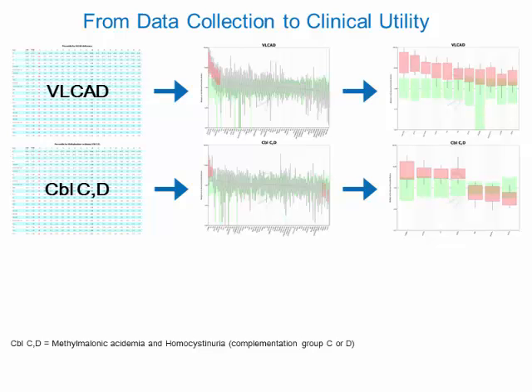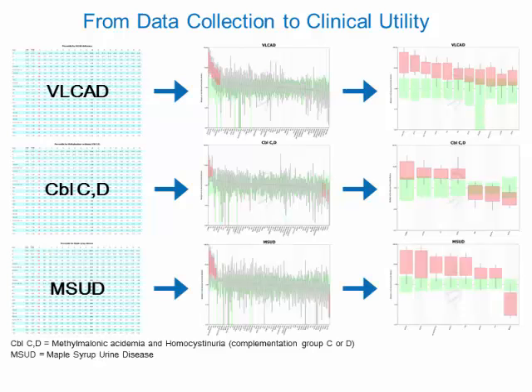The plot by condition of informative species, a combination of acyl-carnitines, amino acids and ratios, is again unique to this condition, showing this time a combination of both high and low informative markers. The final example is a disorder of branched-chain amino acid metabolism, commonly called maple syrup urine disease and abbreviated as MSUD. As you can see again, this pattern is unique.